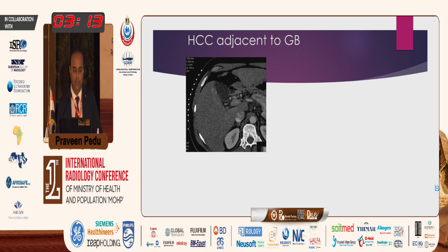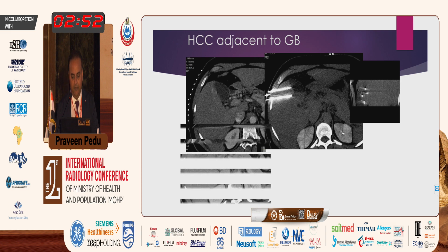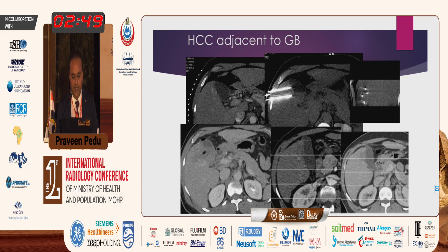So here is an example of a small HCC, again very close to the gallbladder, so not ideal for thermal ablation. You could still do thermal ablation by doing some hydrodissection or putting cold saline in the gallbladder, and again that carries its own issues. Again, IRE fits in very nicely in this situation. You can treat this tumor with IRE needles, and you can get good results as well. Here, this is a follow-up scan performed at 3 months, again showing complete ablation of the treated zone. And what is important is you see very little in the way of scarring after an IRE compared to microwave.